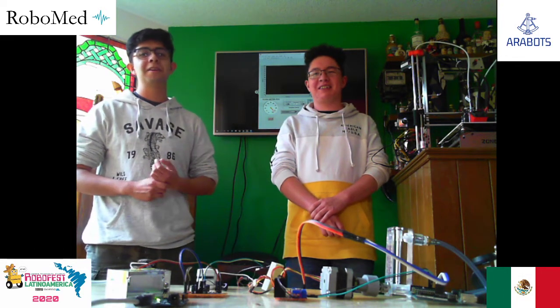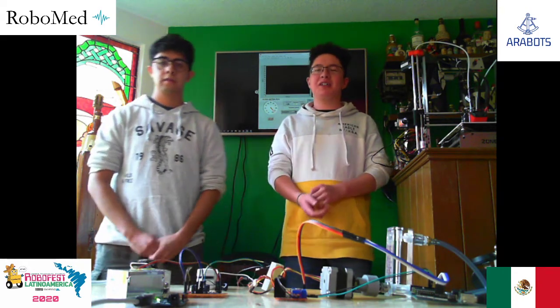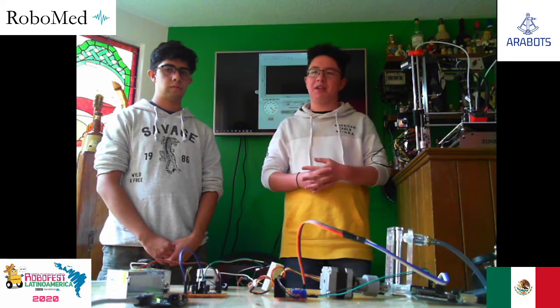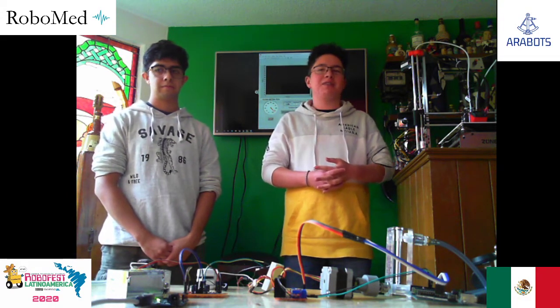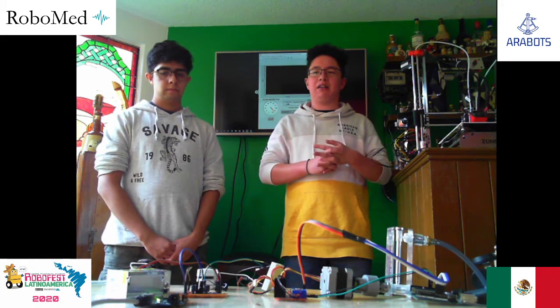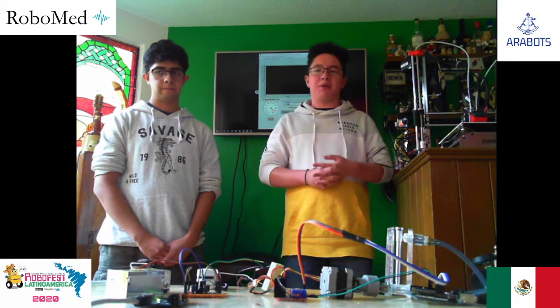Hi everyone, we are the Arabots team and we are talking about a project about oxygen therapy for premature babies. Oxygen therapy consists in supplying a specific quantity of oxygen to the baby until he can breathe by himself. However, this treatment cannot be performed properly because the child must be monitored all the time and the medical staff cannot always be available due to overwork.